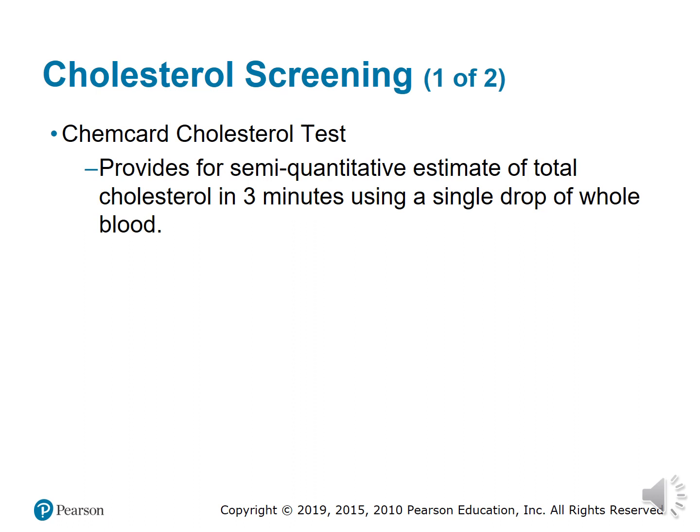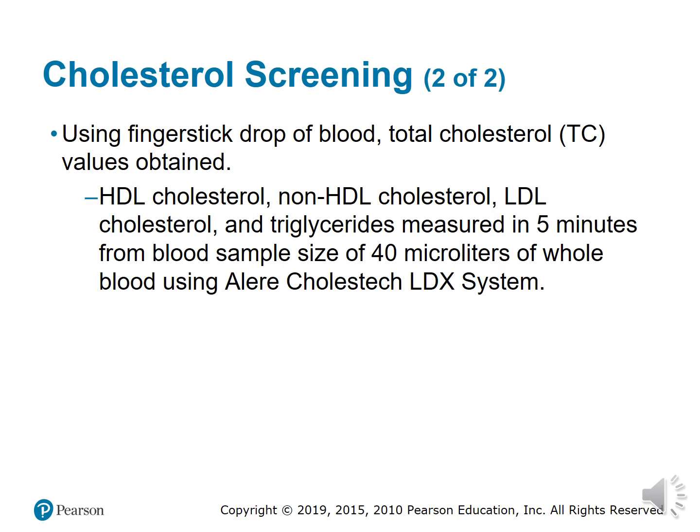Cholesterol testing. As we know, cholesterol tests are semi-quantitative estimates of total cholesterol that in 3 minutes can use just one single drop to determine if a patient's cholesterol levels are within range. And the test that is used is called a ChemCard cholesterol test. It simply uses a finger stick to test for total cholesterol values.